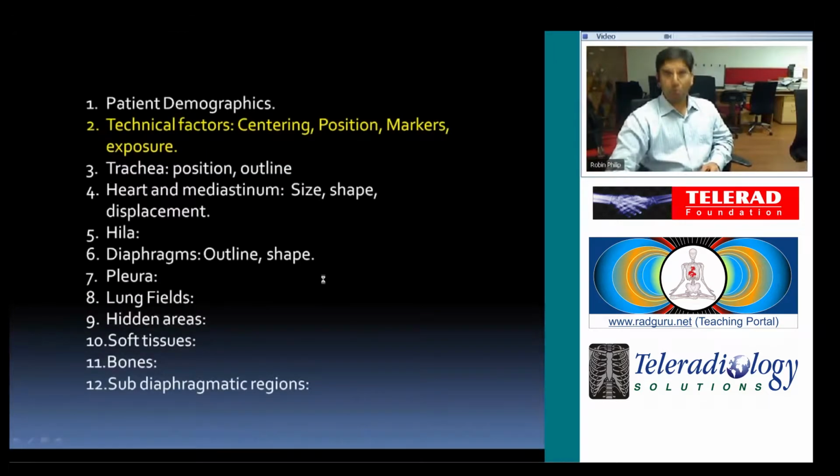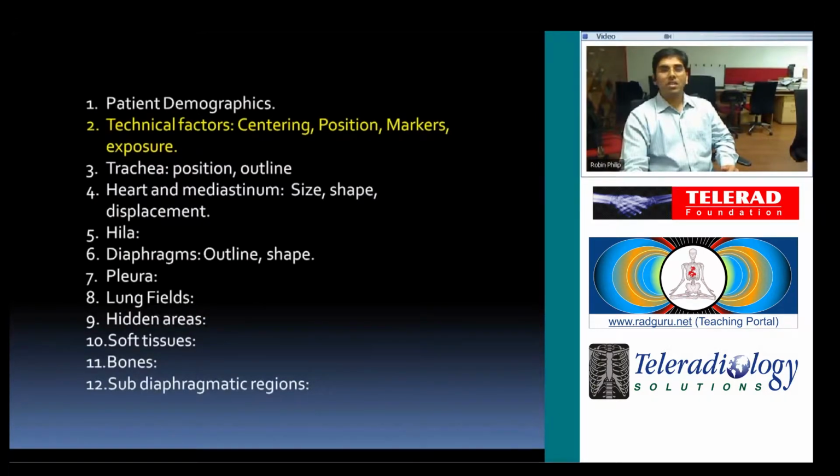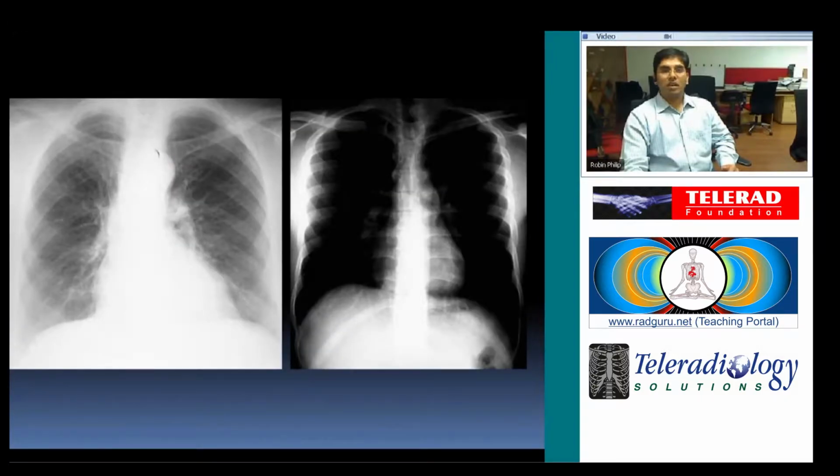Okay. Next, the other factor is the centering. The patient needs to be centered to the cassette or the image capture device. And then there are ways to determine how well it is centered. And then the markers. You have to place the markers on the cassettes or these capture devices.